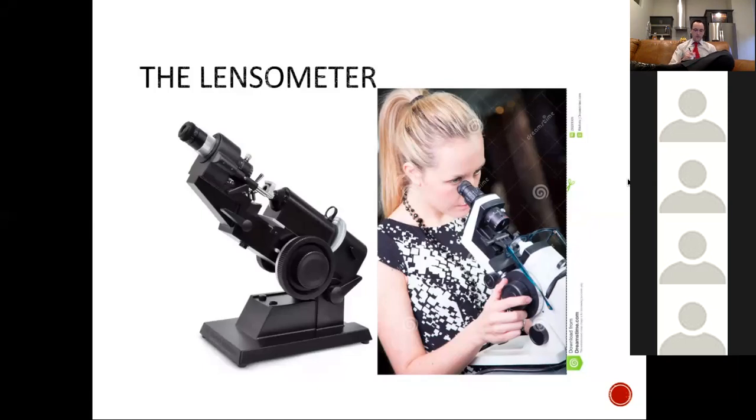So I just want to draw this out here. We notice when we're looking at the spectacles in the lensometer that the temples are facing away from us, right? And because they're facing away from us, we have this little guy here, the lens stop, and that is the area in which the lensometer is obtaining our data. We use the back vertex of the spectacles to determine the distance prescription of our spectacle lenses.